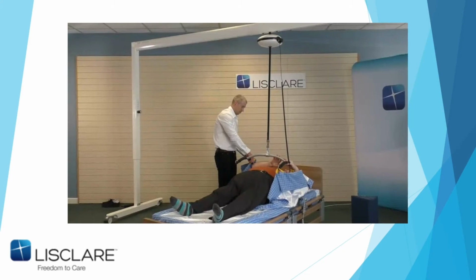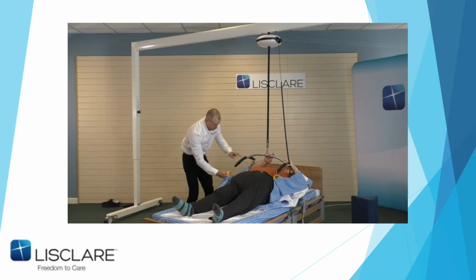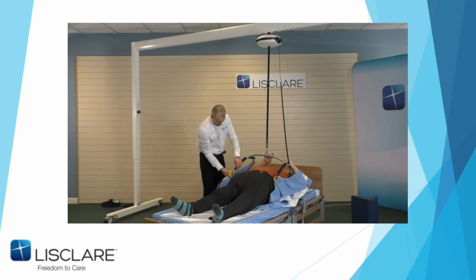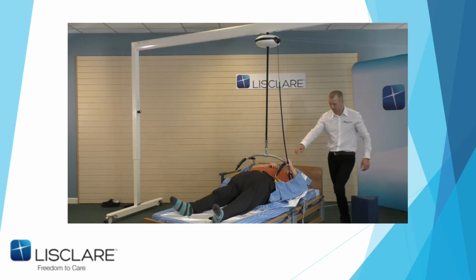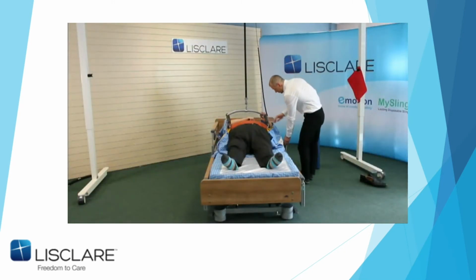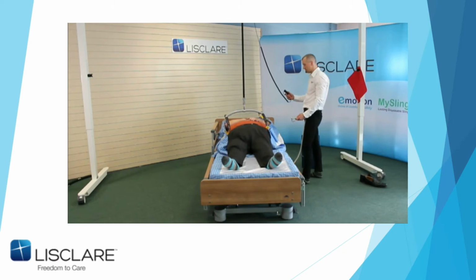Okay. So at this point, when he's got that on, he'll lift the side rail up again. If you don't mind, John, when you're finished getting the loops on, please and thank you. Thank you, John. And then he's going to come round here, because all the controls are there at the minute. And basically, the bed, I don't know whether it's low enough, John, but you can take it up in height. Just shimmy my bum. To the height of the hoist, John.